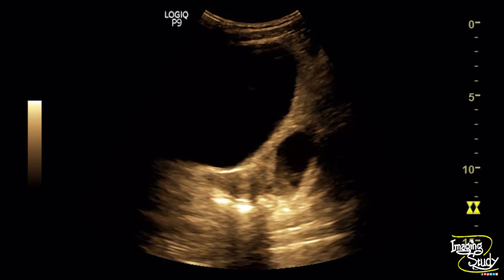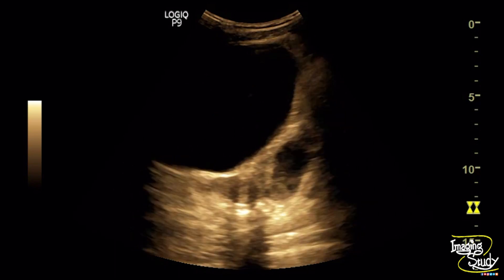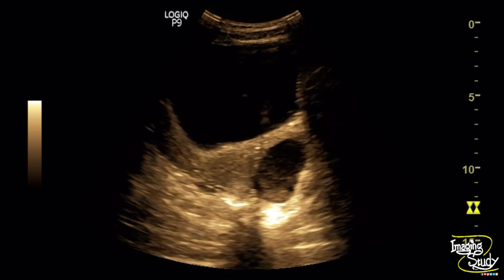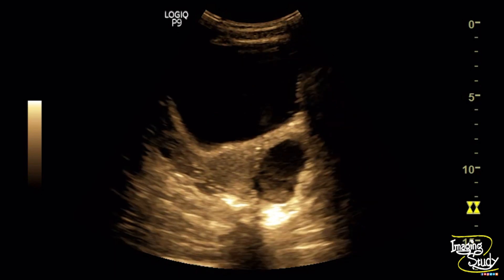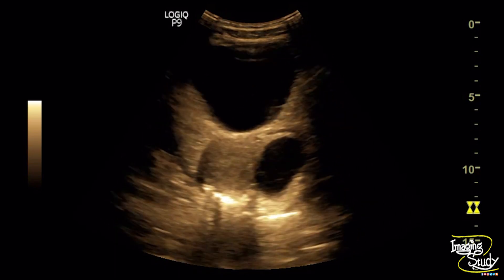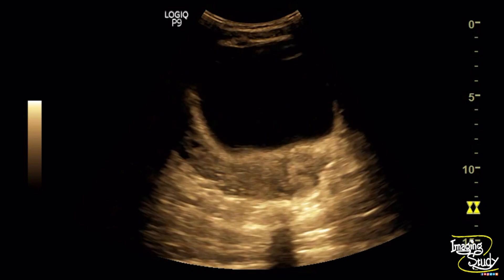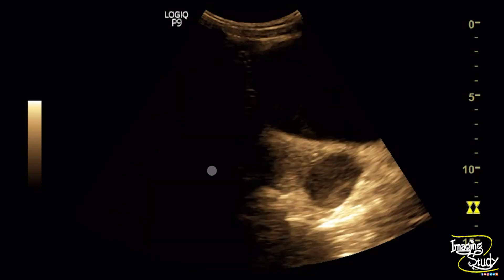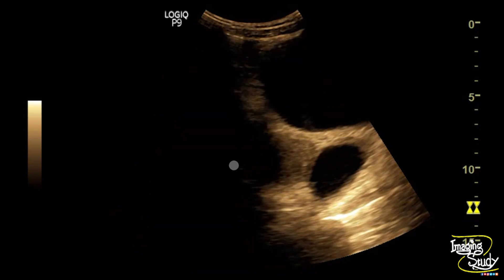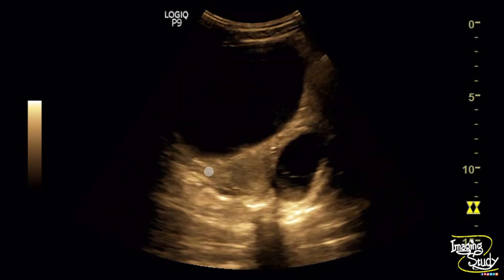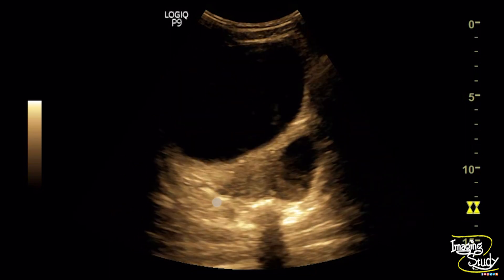The left ovary could not be separately visualized, which indicates that this might be of left ovarian origin. The right ovary looks quite normal and the features of the lesion suggest hemorrhagic cyst.